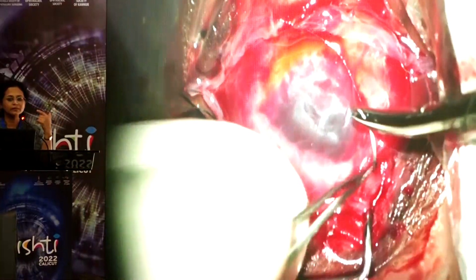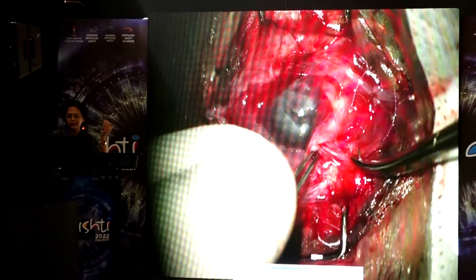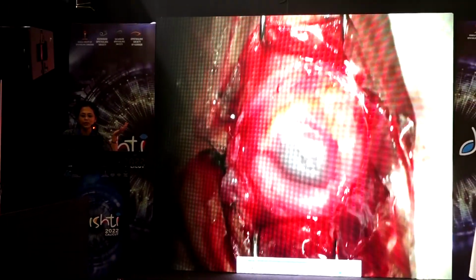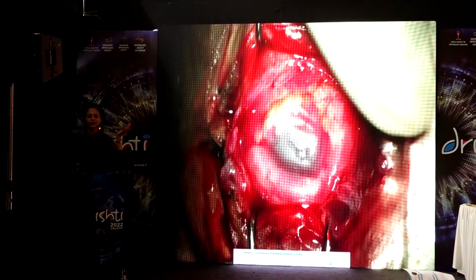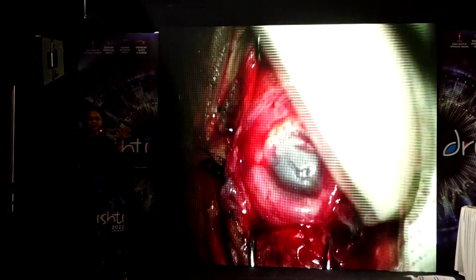The membrane is almost put into place here. Much of it is sutured. If you have extra membrane, sometimes instead of doing it with a single membrane, I go and do 2 membranes also. So it becomes a bi-layered or multi-layer technique, so that this allows the membrane to stay on the surface for a long period of time. You can see this is very well positioned here. So I put in a double-layered membrane over here, covering the entire region of epithelial surface damage.